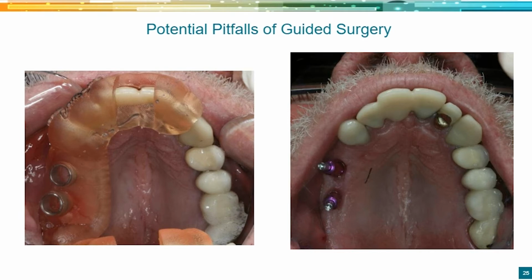And as most of you can maybe start to already guess, what happened here is, when going back to the posterior implant, the pivot point became the tuberosity, and the soft tissue tuberosity obviously is not a hard tissue support, and so the guide rocked. And there's a window in the front, but perhaps we weren't looking at it, my assistant and I, because everything felt stable. And so the posterior implant got a little bit of a lean to it.